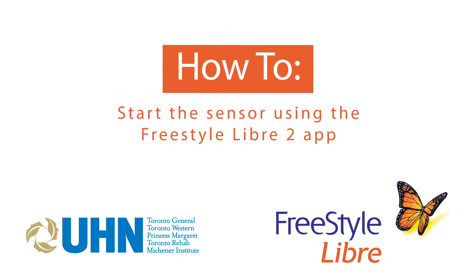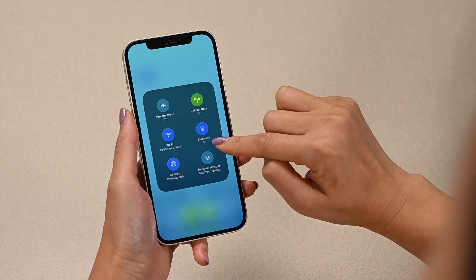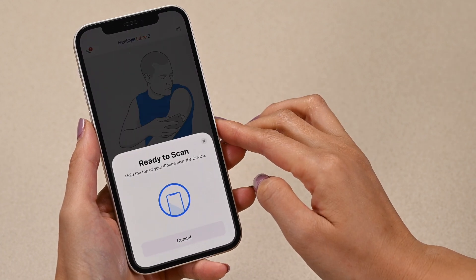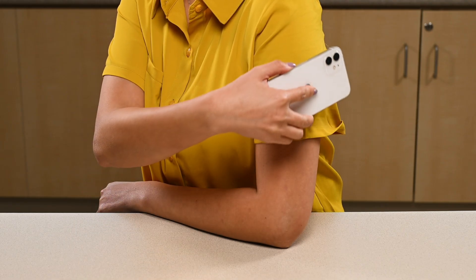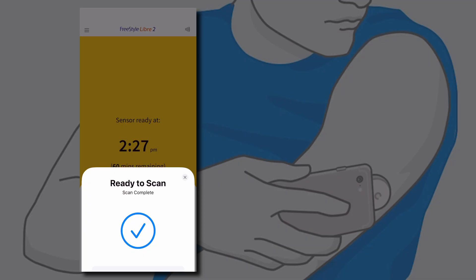How to start the sensor using the Freestyle Libre2 app. First, make sure that your Bluetooth is turned on in your phone settings. If you have an iPhone, tap Scan new sensor. Hold the top of your phone 1-2 inches from the sensor on your arm. You will hear one beep when the sensor has started.